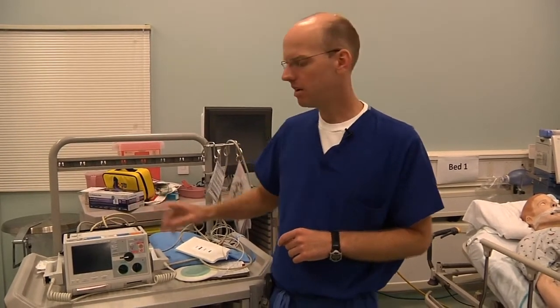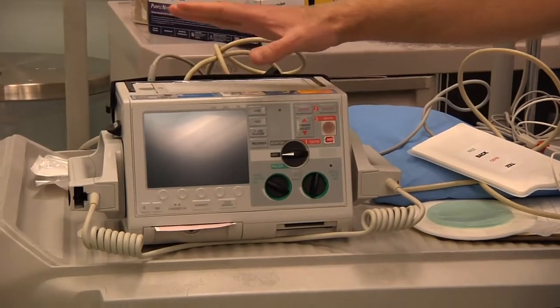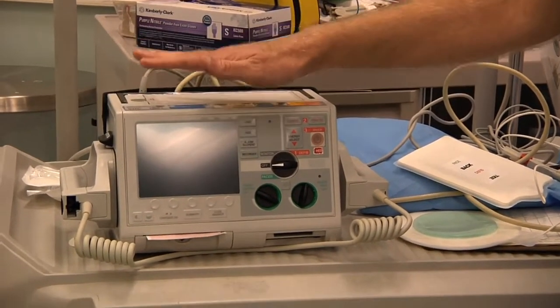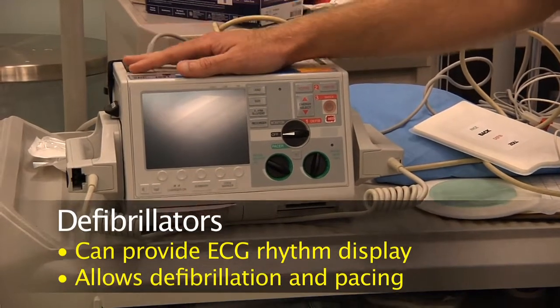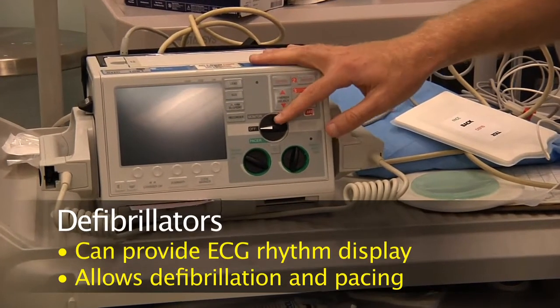This one I'm going to go over. Obviously, yours are different, but there's a lot of similar features with all pacemakers and defibrillators. Now, let's briefly talk about what it can do. All defibrillator pacemakers, unless it's an AED, can give you a rhythm, so it's a good monitor. If you ever are lacking an ECG, you can always use your crash cart monitor. In addition, it allows you to defibrillate and pace.